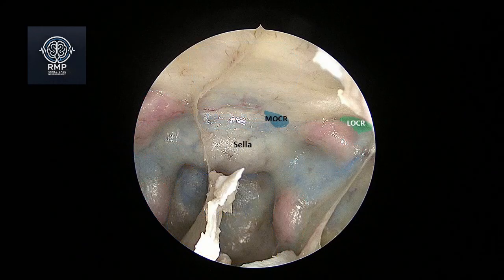Laterally, we find the lateral opticocarotid recess, a consistent bony landmark that guides identification of the optic nerve and internal carotid artery. This recess corresponds to the optic strut. And medial to that, behind the carotid's anterior bend, the middle clinoid process marks the origin of the caroticoclinoid ligament and the roof of the cavernous sinus.